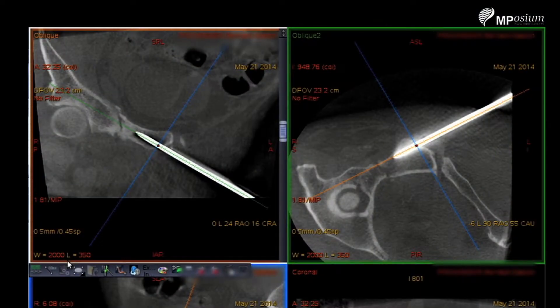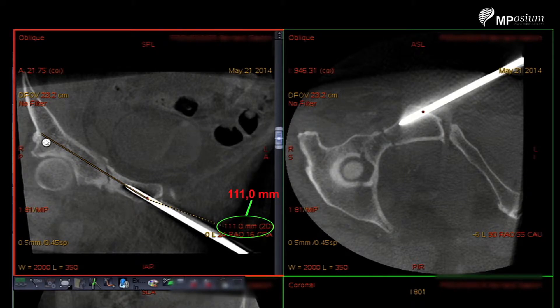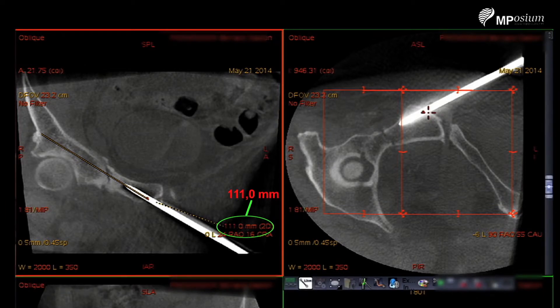We will also measure the length of the cannulated screw to be inserted. The measure will be from the entry point in the bone up to the cortical. Continue, continue, voilà — click. We have here 11 cm. We will also perform this measure in another plane. This is the second measure to be sure of the length.